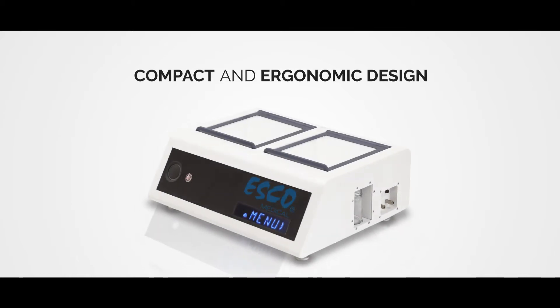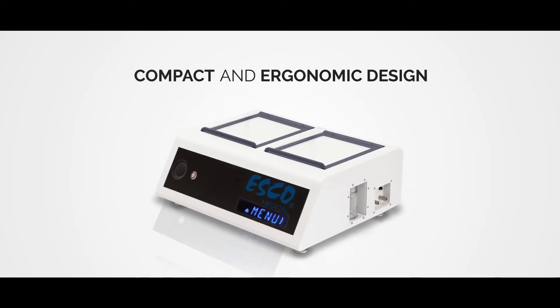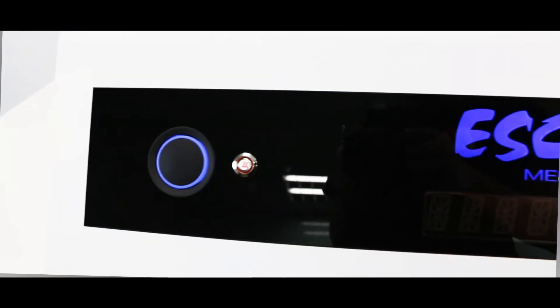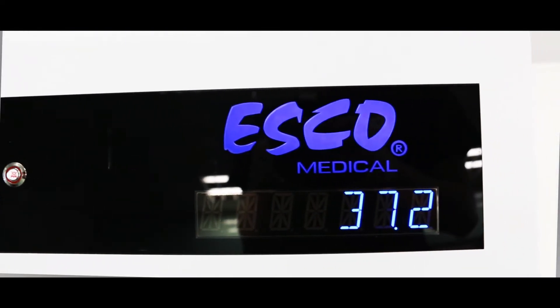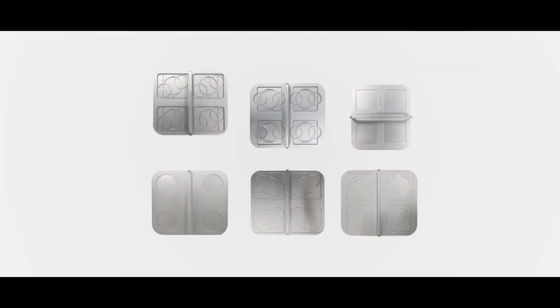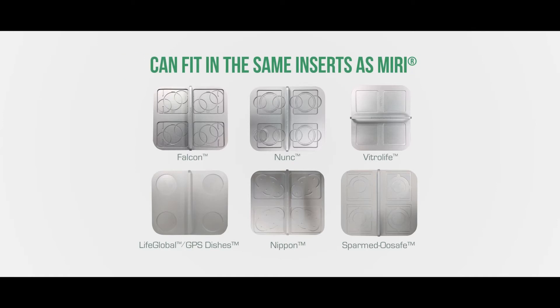You have more reasons to love the MiniMiri. With its compact and ergonomic design, it will fit perfectly inside your lab. It also has a writable gas lid for easy patient identification and a large LED display that can be easily seen from a distance. It is flexible too, and it can fit in most dishes with our choices of inserts.